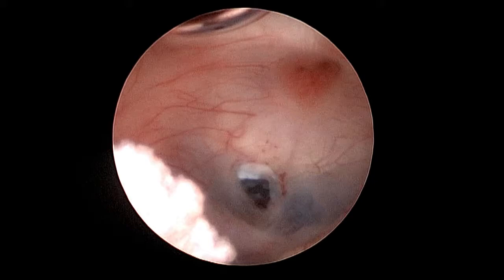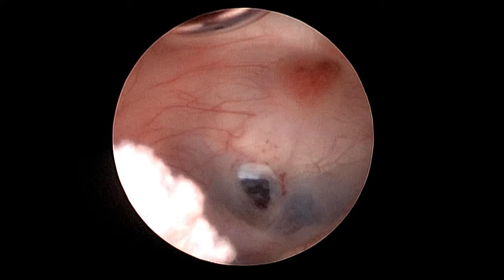Finally, the endoscope is withdrawn from the third ventricle and from the lateral ventricle. The cortical puncture channel is inspected for potential active bleeding.